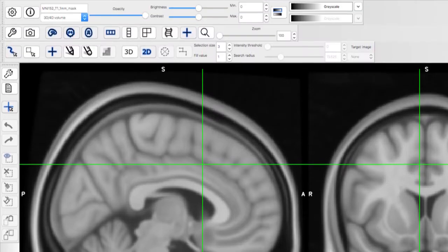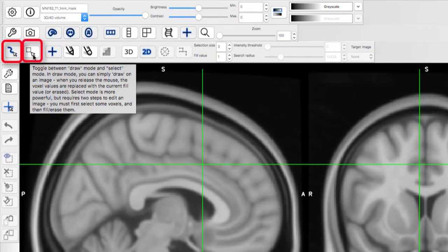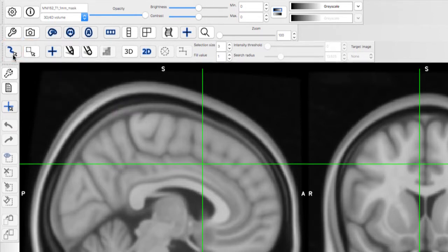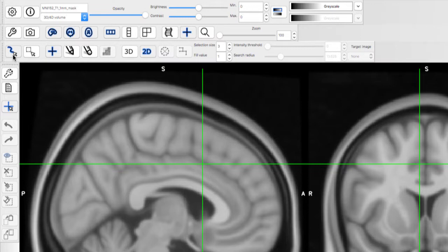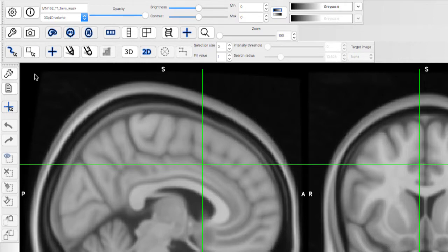Next, take a look at these two buttons, Draw Mode and Select Mode. Draw Mode allows you to start selecting voxels and fill them in with numbers. For most ROI analyses, you will want to leave the fill value as 1 so that data is extracted only from those voxels.